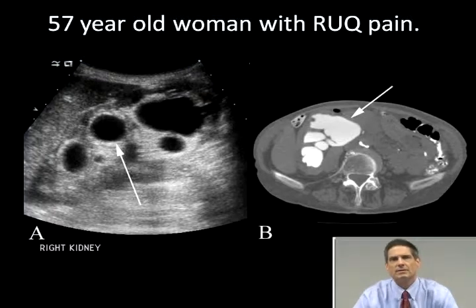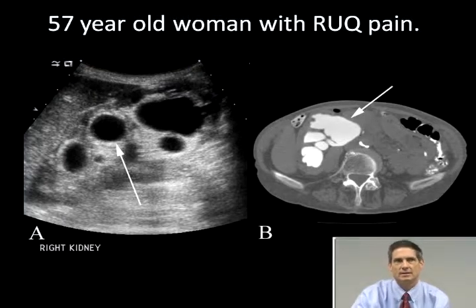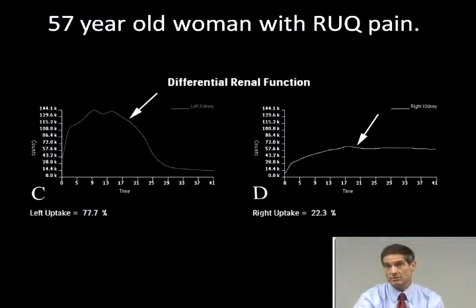The dilated collecting system can sometimes mimic multiple cysts on ultrasound, but with real time or with multiple images, you can get all those cysts to kind of join together to the renal pelvis, and you actually see a dilated renal pelvis. In this particular case, the urologist ordered a nuclear medicine study which confirmed significant differential function and a time activity curve on the right, diagnostic of chronic UPJ obstruction. The patient underwent pyeloplasty to remedy the obstruction, and that relieved her pain. So here's a case where ultrasound showed you something that you needed further workup for with other imaging modalities.